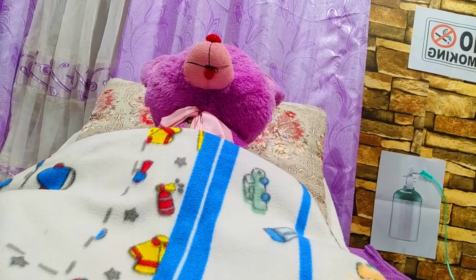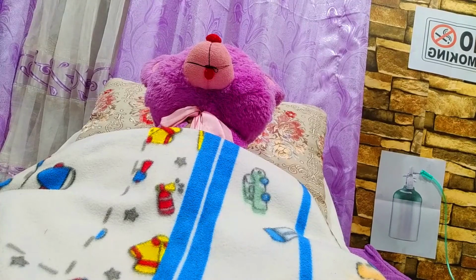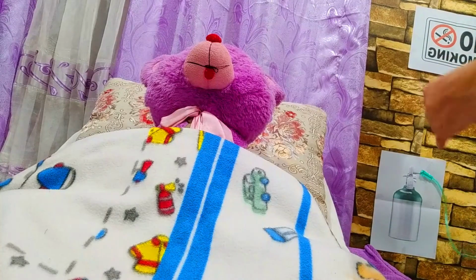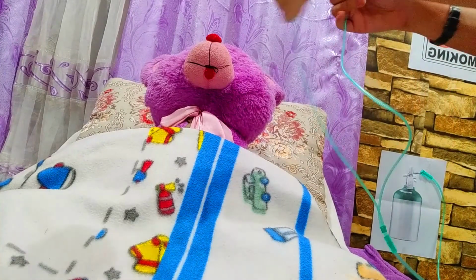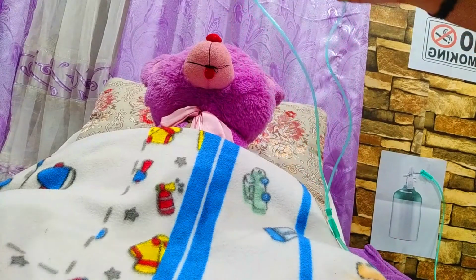We need to hold the cannula so the prongs are pointing up toward the ceiling and curve down towards me. So here, towards the ceiling.